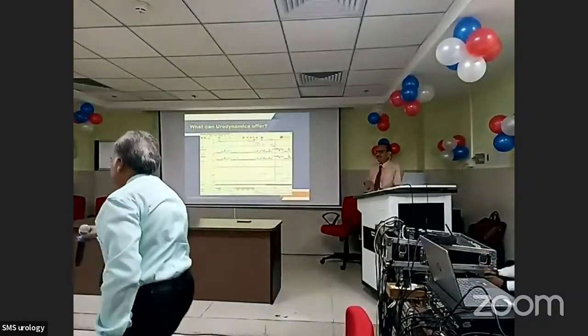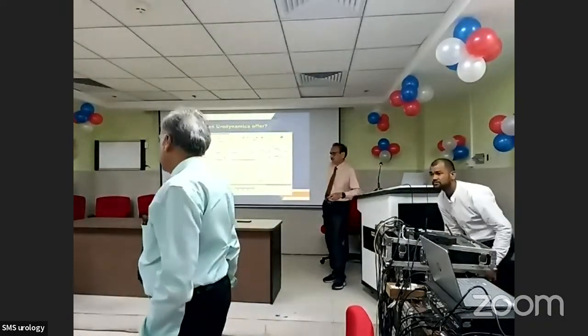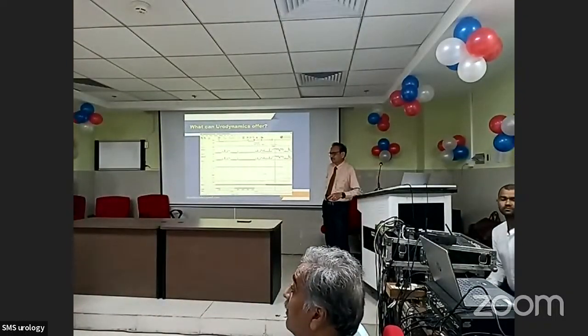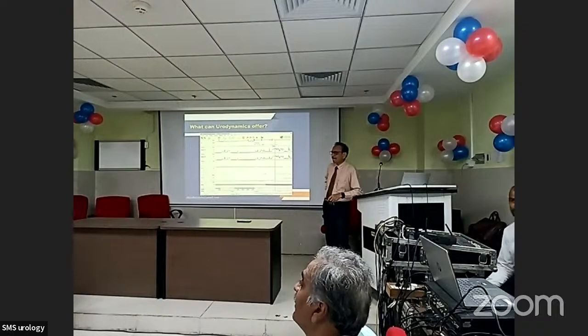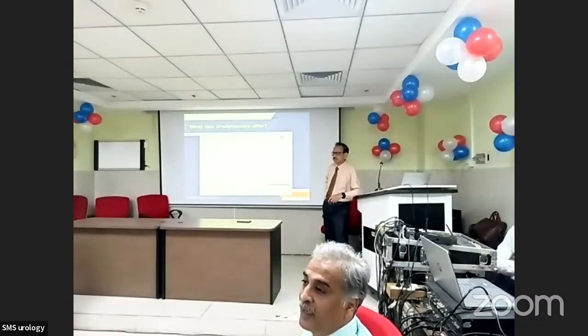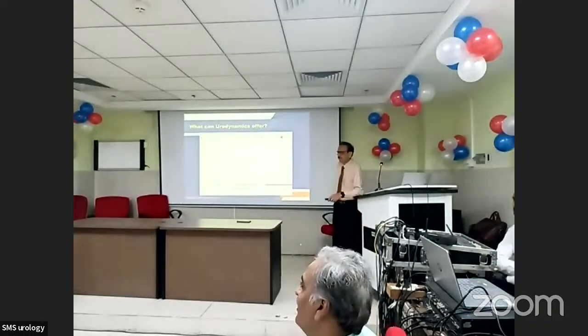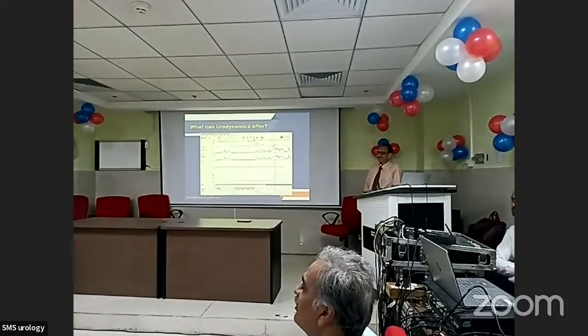I want to ask a question. Yes. Sir mentioned DSD is always related to a neurological problem, usually suprasacral. So what carefulness or what things should come to your mind when you're doing cystometry in such patients? What can happen? Autonomic, so which drug do you take? Always keep that in mind.